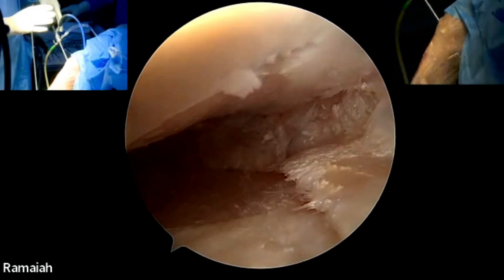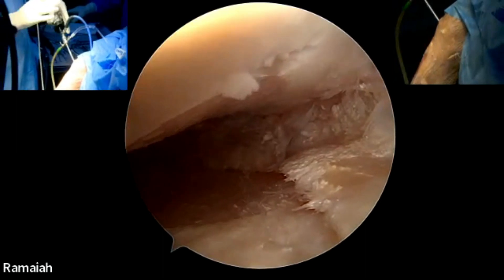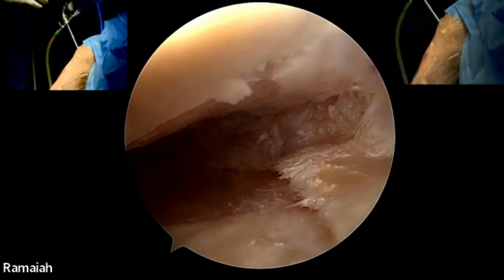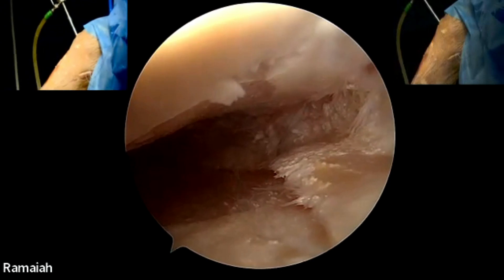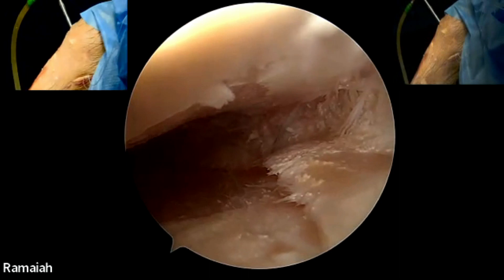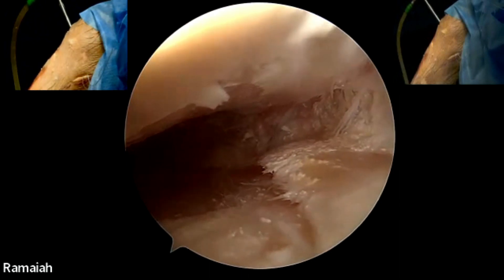We are going to demonstrate inside-out meniscus repair in a medial meniscus. I feel this is a very good technique for bucket handle tears, especially for horizontal cleavage tears with parameniscal cysts — a very nice technique for that, and it is cost effective also.